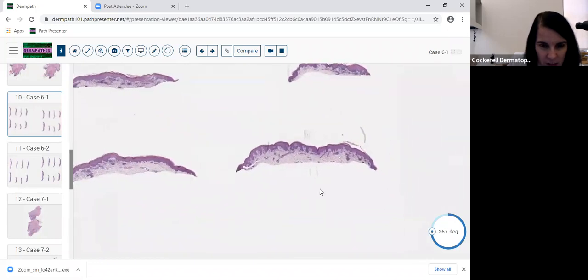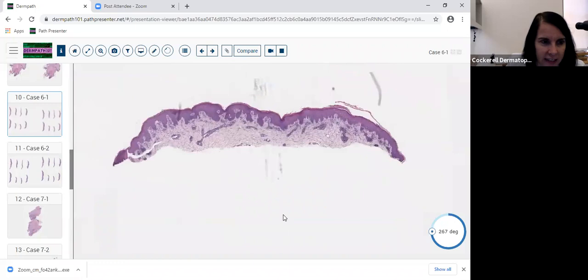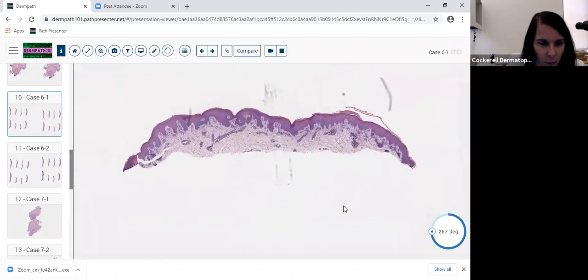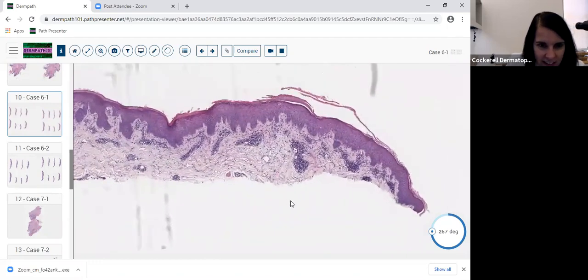This is an interesting case. You have a shave biopsy, and this is a pretty good shave. I mean, they didn't do a punch, and they were suspecting an inflammatory dermatitis. And you're looking at this and saying, wow, this is somewhat psoriasiform. It's acanthotic and somewhat irregular psoriasiform. Is this psoriasis? Well, let me drill down and see.